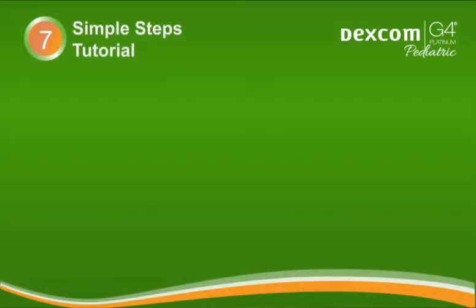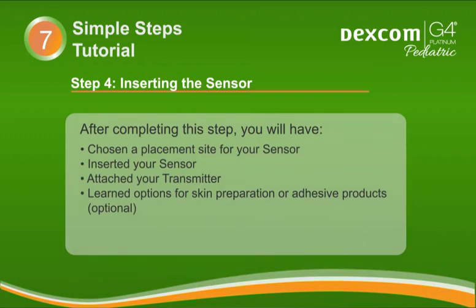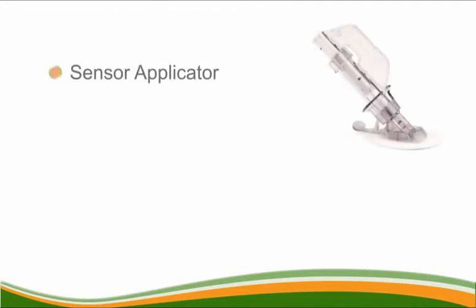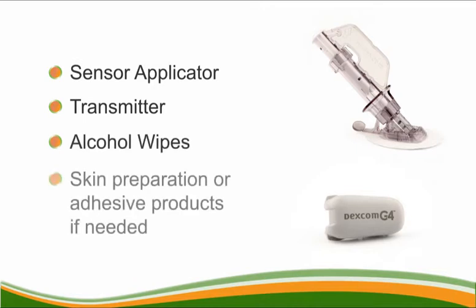Now that your initial setup is done, it's time to learn how to insert a new sensor. After completing this step, you will have chosen a placement site for your sensor, inserted your sensor, attached your transmitter, and learned the options for skin preparation or adhesive products. Before starting this process, you should have a sensor applicator, your transmitter, alcohol wipes and skin preparation or adhesive products if needed, for example, skin tack or mastisol, ready to go.